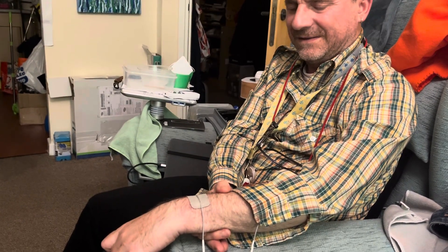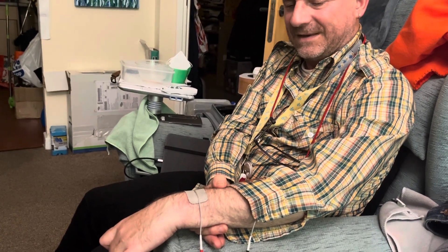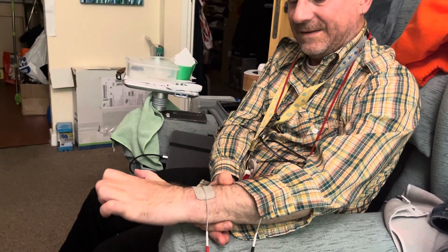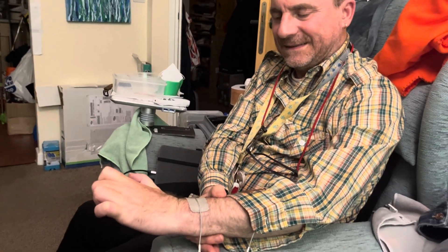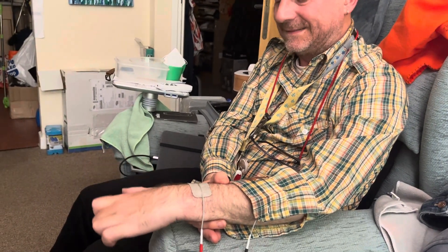It's uncomfortable — it's electrical, like tingling electric shocks up my arm. It's not really pleasant. But if it helps, then yeah — if it does that to you, you know. This could be shoulders and hamstrings next.